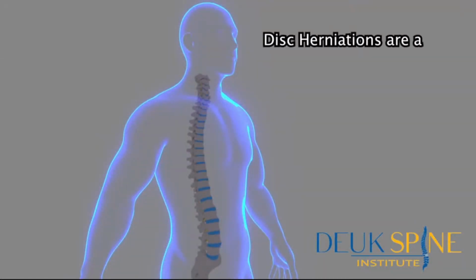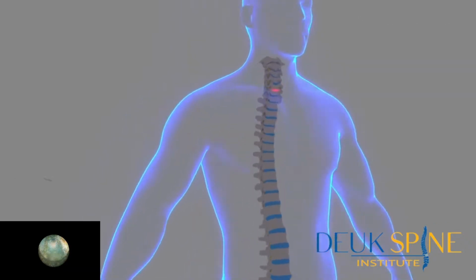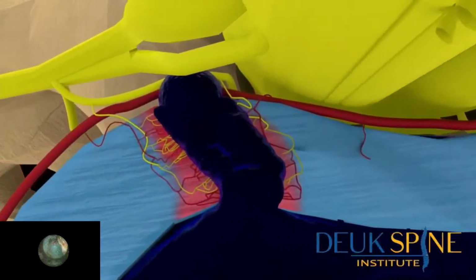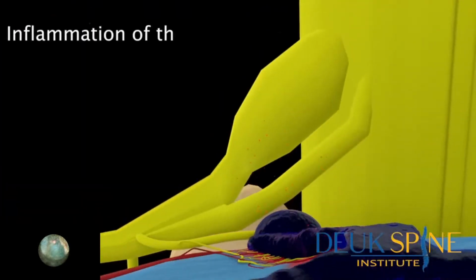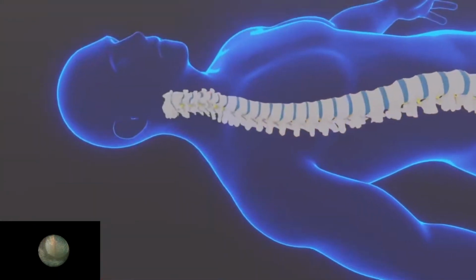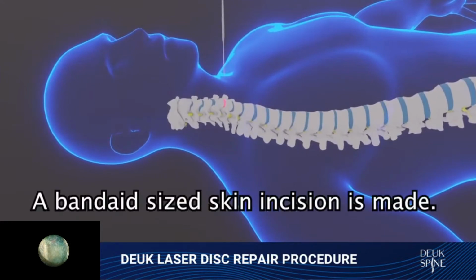Disc herniations are a common cause of chronic neck pain. The inflamed annular tear causes neck pain. Inflammation of the nerve roots causes arm pain. A Band-Aid-sized skin incision is made.